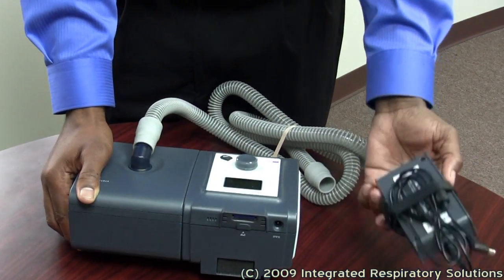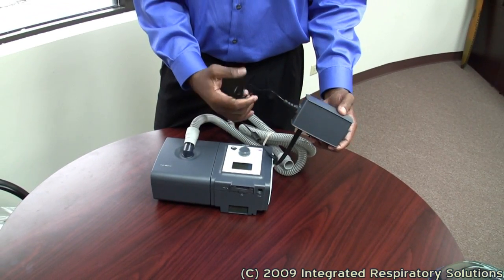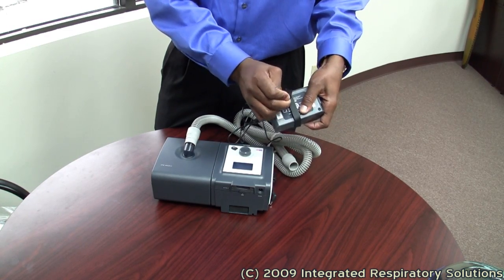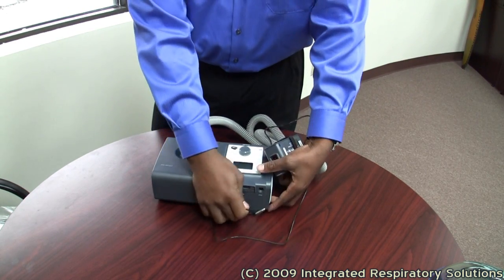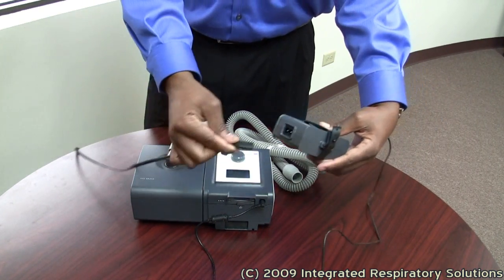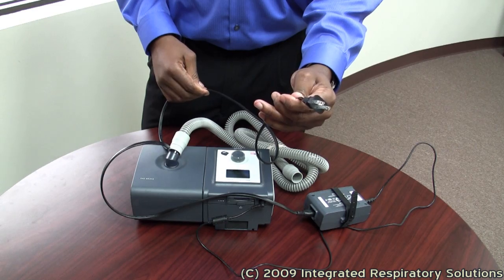The power supply. Most CPAP BiPAP devices are able to convert from 110 up to 240 volts. This piece will automatically adjust based on where you are in the world. This end connects there, and that is the only place you connect that piece. These two come together just like that, and obviously this end must go to the wall.